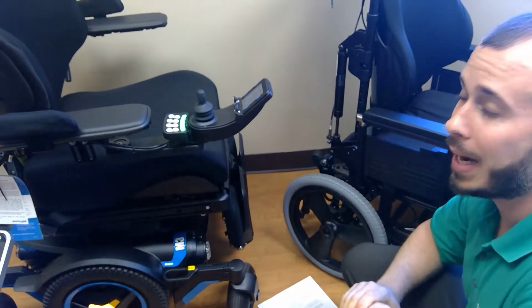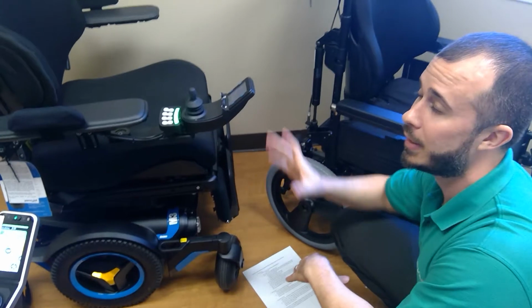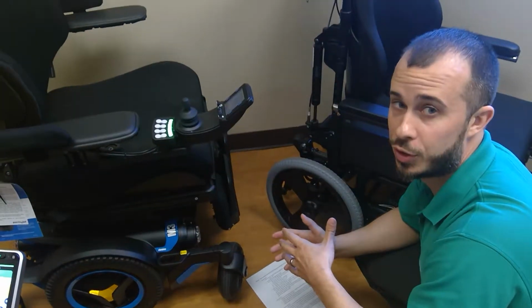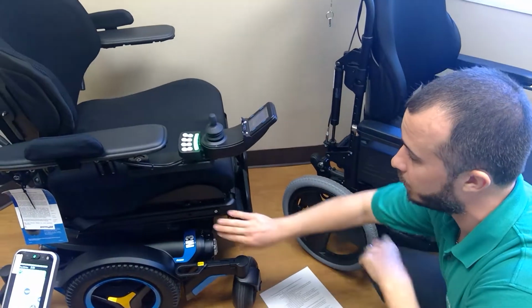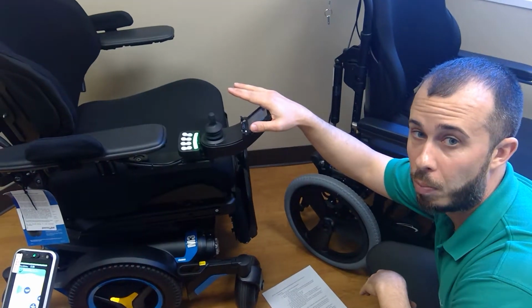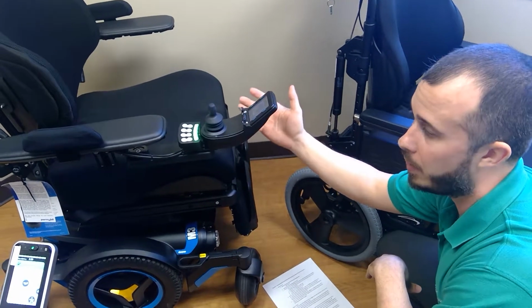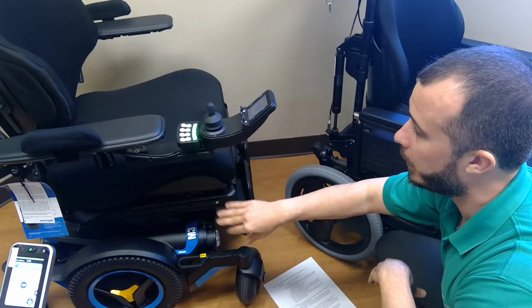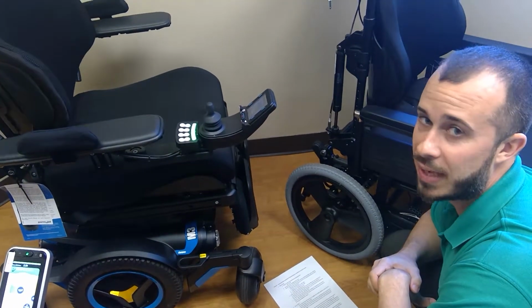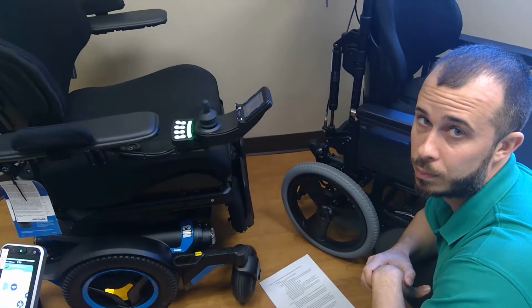Now, things to think about with a power wheelchair. You have controls, you might have cup holders, you might have other things attached to this chair. So again, it's going to be very important to talk about what kind of obstructions do we have. In some cases, you might be able to mount to this chair and sneak the mount up and under the actual control arm. Or you might have to go to the other side of the chair because it's going to run into this, or maybe the client transfers out of this side of the chair and we don't want this mount obstructing their ability to transfer. So just questions you have to ask with the customer and figure out where the best solution is going to be for that individual. Okay.